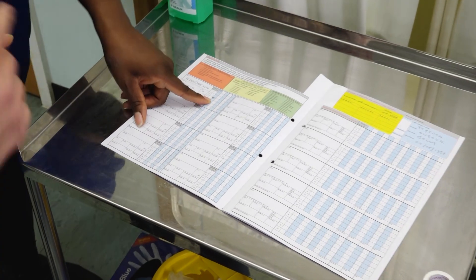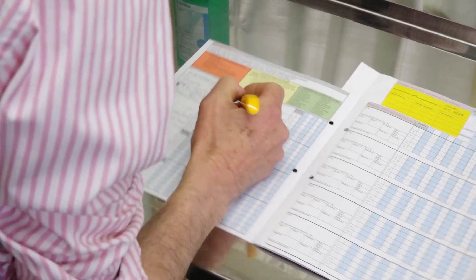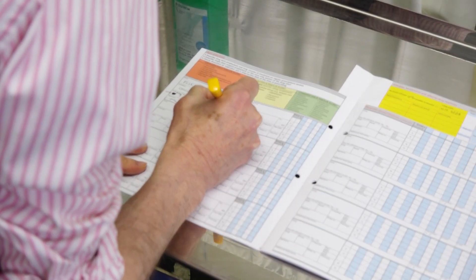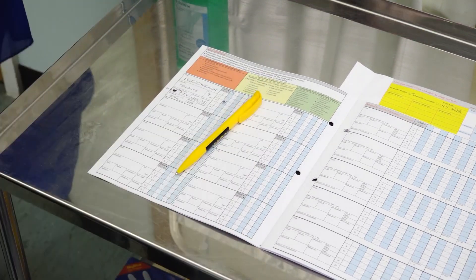Sign the drug chart and make a note of the procedure in the patient's notes. Thank the patient and dispose of the waste appropriately.